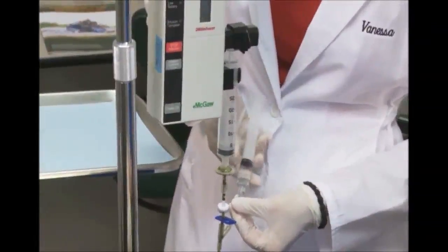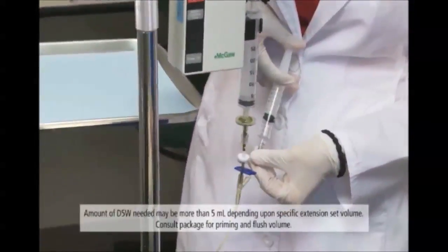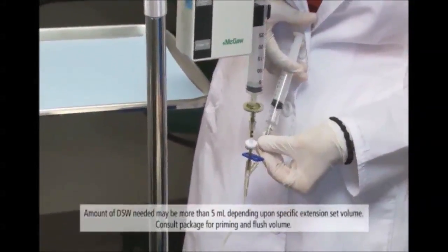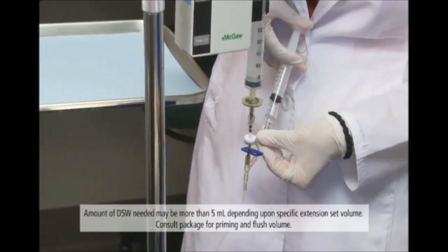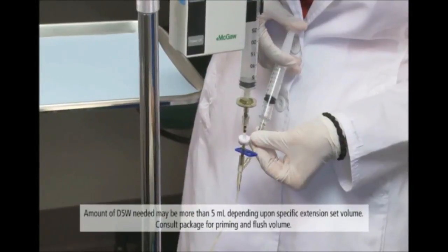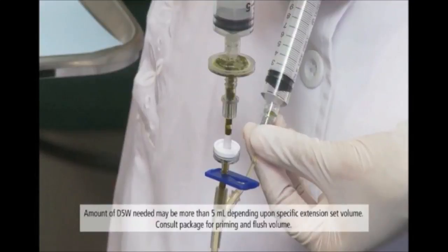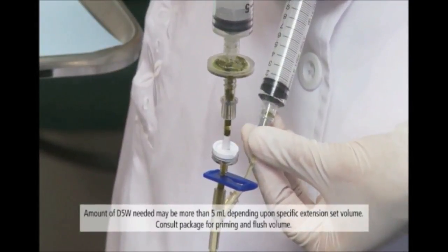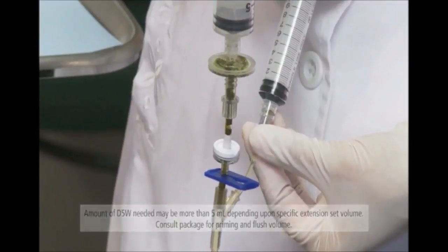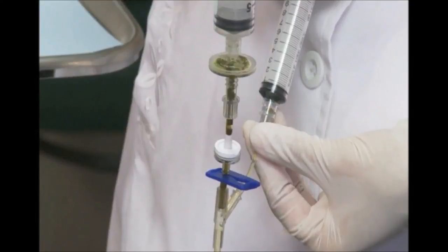Laser treatment preparation begins with the insertion of the remaining syringe containing 5 mL of D5W into the side port at the top of the IV extension line. Slowly flush the IV system manually for approximately 60 seconds, allowing the remaining Visudyne solution to be delivered through the vein. Take precautions to prevent extravasation at the injection site. If extravasation does occur, immediately protect the injection site from light.